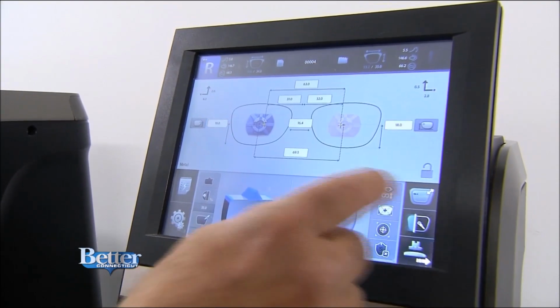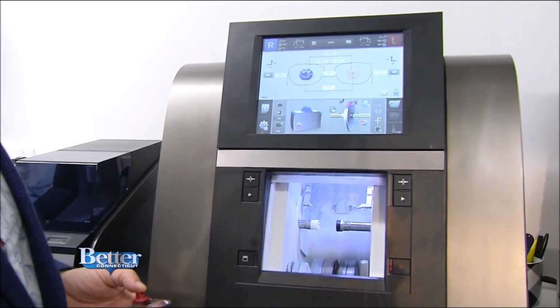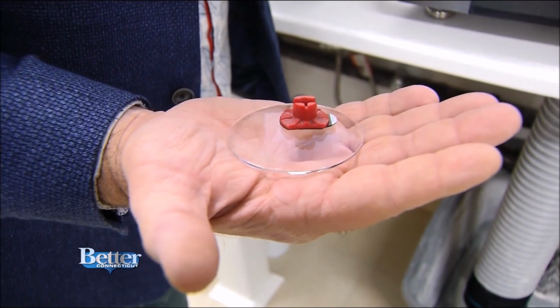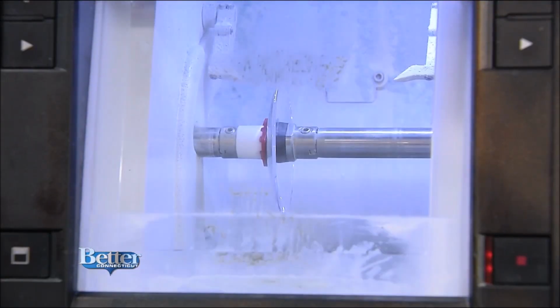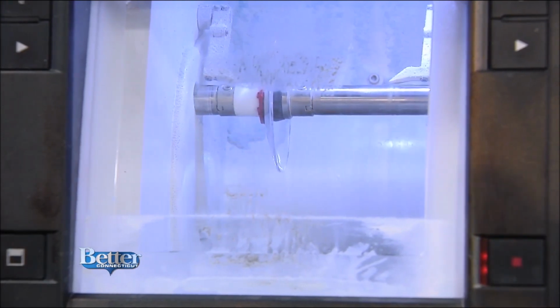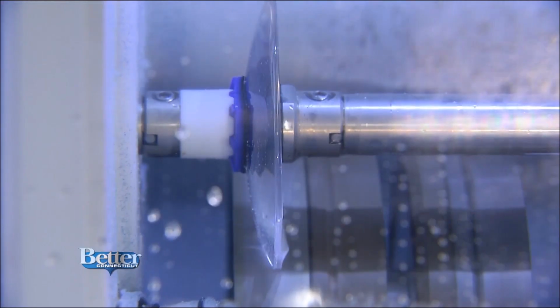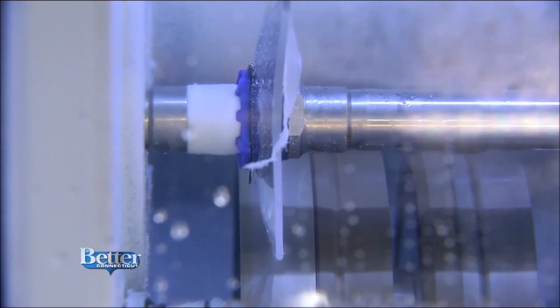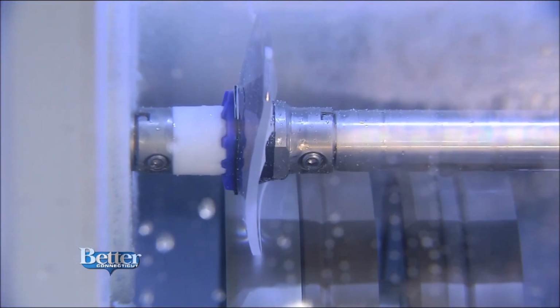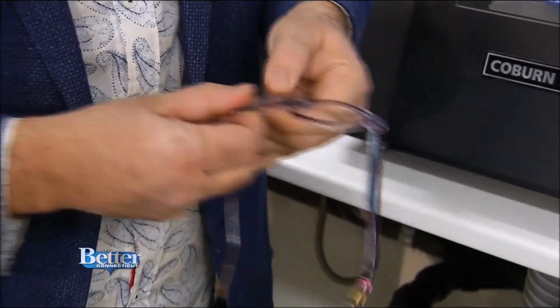After other important information is entered, the image captured here is then sent on to this machine. That's where the lens, which has arrived from the lab with the correct prescription information, is inserted. And you'll see that there's a roughing wheel, which is made up of small diamond chips, and then it will cut it down to its basic shape. And once it's done that, it needs to create what's called a bevel. And once it's done that, you'll see that it will insert the lens into that frame and it will fit perfectly every time, one time. It really is a remarkable process.